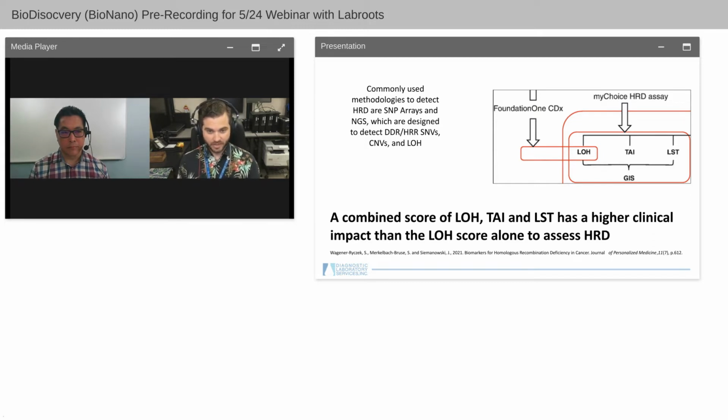Collectively, as we aggregate what they do evaluate, and this is a data evaluation of being able to visualize that they are happening in the tumor, it is that more data is better data. So the aggregation of all of the states seem to have a better predictive response than just evaluating one.